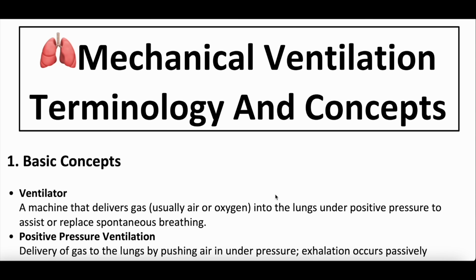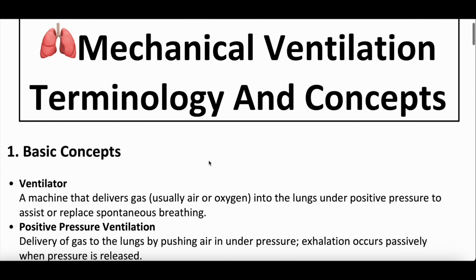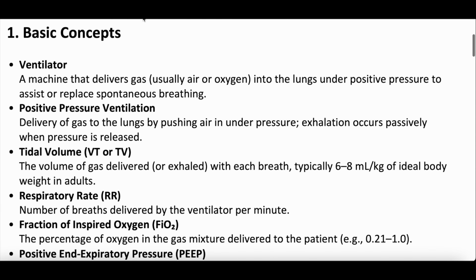Let's dive into the concept today. So mechanical ventilation terminology and concepts, starting with just basic concepts.